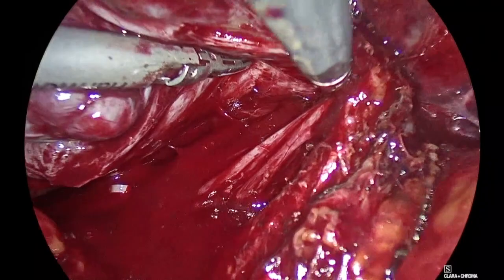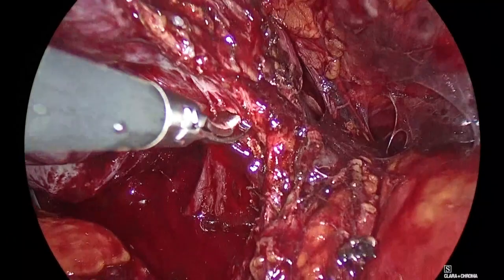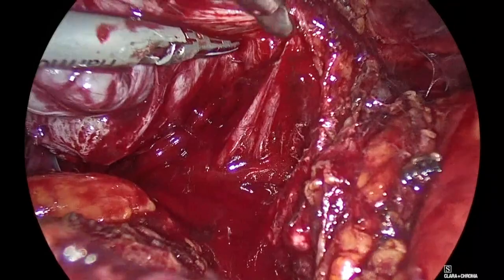You see this? This lateral move is very important. And then when I prepare myself and I actually make a window before I start with a clipping thing, if it manages to clip the whole thing, it's good. If it doesn't, I'm already ready for the whole movement. This is something I could cut also. I don't want to cut there. It was done not purposely, believe me.